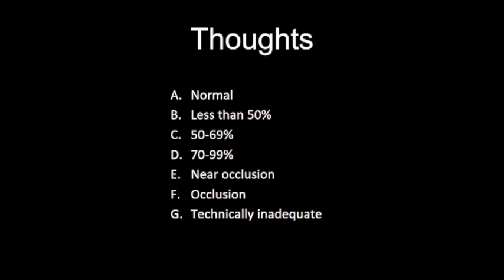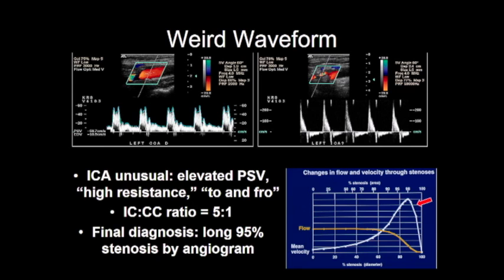Oh, I got an E. F, G. G, technically inadequate. It was, well, it was the best we can do. So I got one vote for one E. So I don't know who you are, but you're a genius.